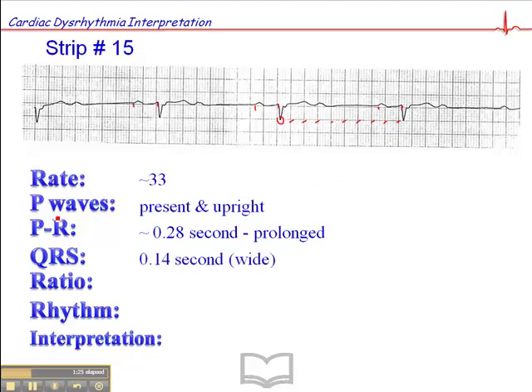The QRS is about 0.14 second or wide. So the question is why is it wide? Because we have a P wave preceding each QRS, so presumably there's some aberrant conduction going on here.